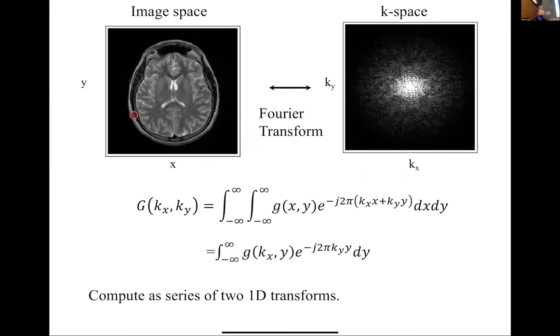Okay, so remember, pretty much what we've talked about up to now is that if I have some object, I want to take its Fourier transform. And this is the data we collect in K-space. And we then inverse transform this, right? The data are still going to be collected in K-space in MRI, because that's just how we do it. At least, even the techniques we talk about will typically still be K-space data.